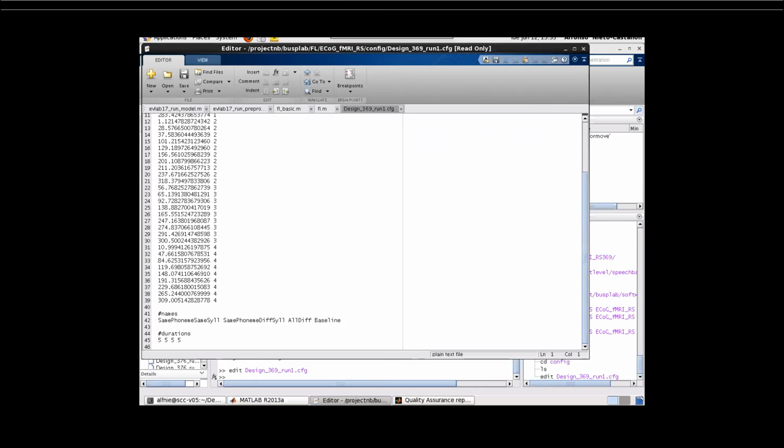This is confusing to me. You mean ran the scripts a couple different ways? Yes. Okay, because I thought this experiment was different. But in terms of SPM, when you specify the onsets and durations in these config files, 0 corresponds to the beginning of the first scan. That's the reference time. Even if you apply slice timing correction and your reference slice is in the middle of the first scan, that doesn't matter. SPM does correct for that, at least now.